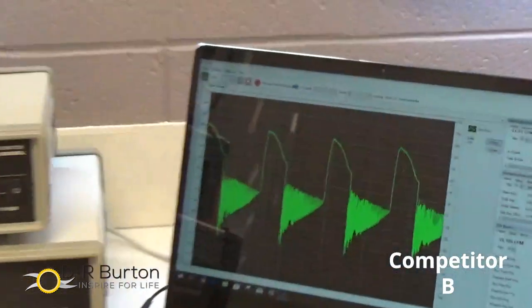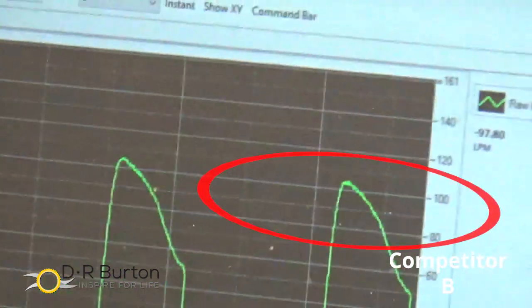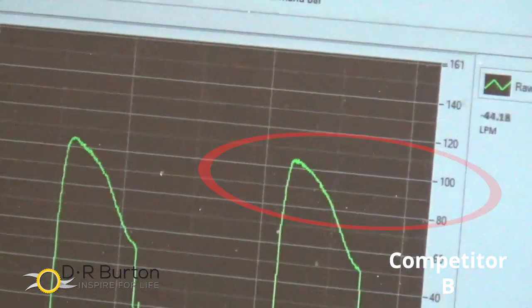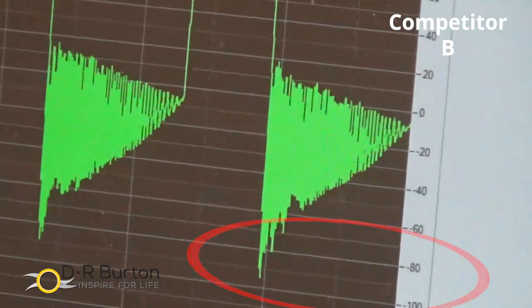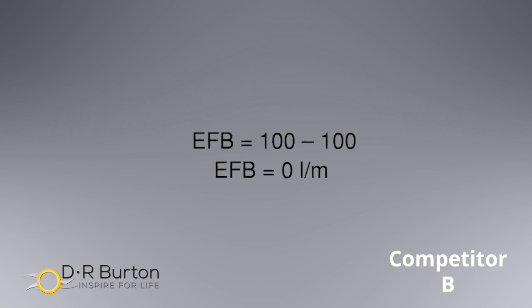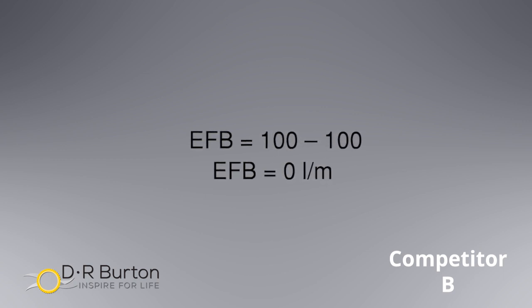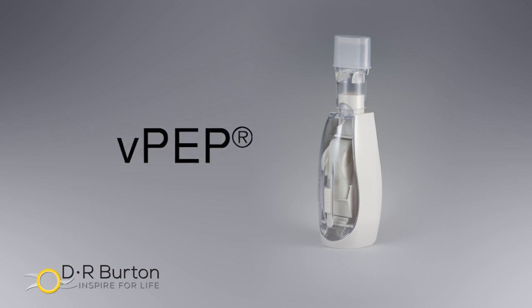Lastly, we compare the flow loops with the other competitive OPEP device. As we zoom in, notice that the peak inspiratory flow is about 100 liters per minute and the peak expiratory flow is also around 100 liters per minute. With nearly equal peak expiratory and peak inspiratory flows, the resulting expiratory flow bias is zero — there would be no net movement of secretions. This lung box demonstration shows that the VPEP has by far the greatest end expiratory lung pressure and the greatest expiratory flow bias, which drives secretion clearance.